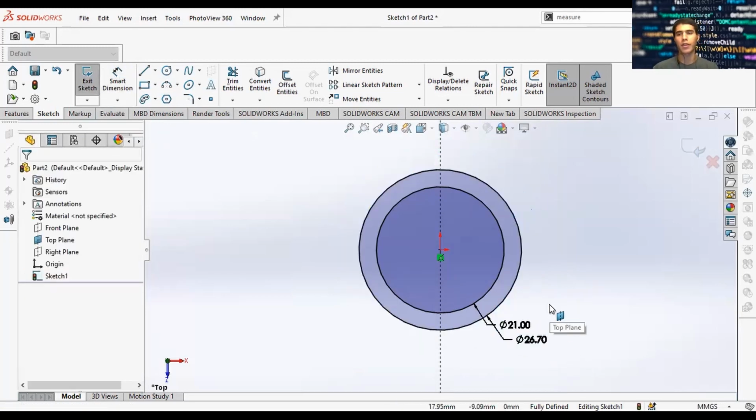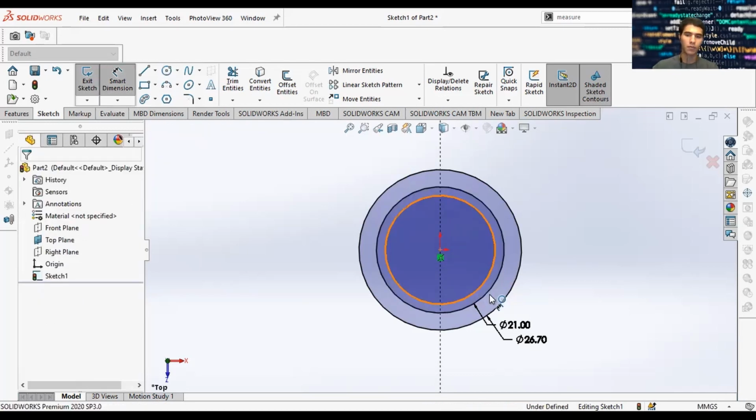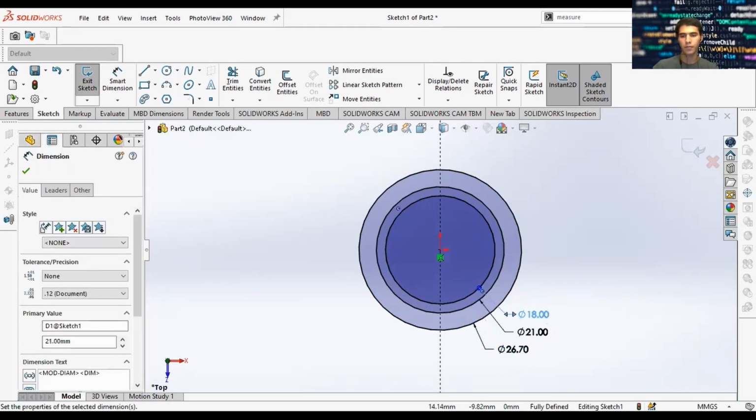So the way it works is you have an inner annulus and you have an outer cuff. The outer cuff is what gets anchored onto the native tissue. The inner annulus creates the opening for the heart valve. So we'll go ahead and say that this is 18 millimeters. And I think we are good there.